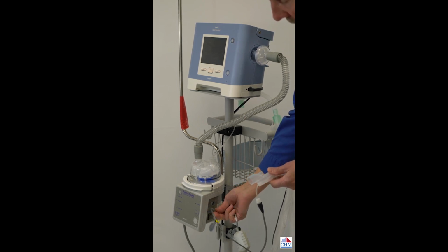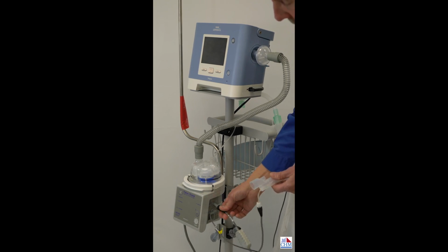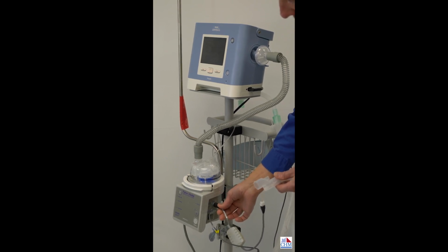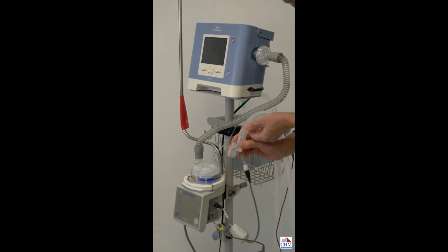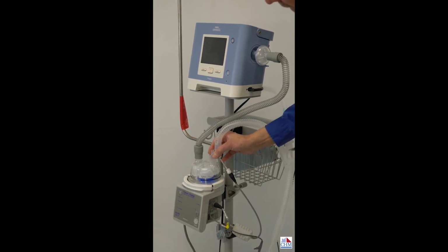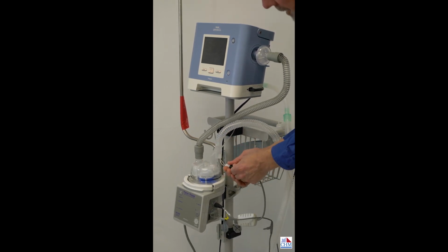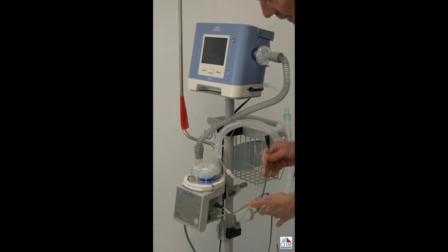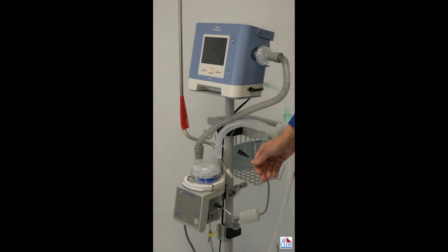They'll only go into one spot, and they are marked on the side of the humidifier. You might need to rotate this one just a little bit to get it to slide in. It should fit in nice and easy. And then we'll go ahead and attach our tube here, and then I'll show you the hookup for the heated wire adapter. Now these may be a little bit different depending on the type of circuit that you have, but the concept is the same.